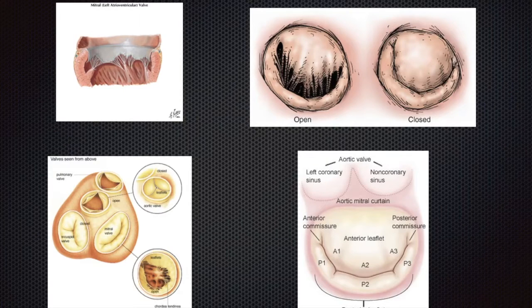So here's just drawings to show you what they actually look like. So it's a bit like a smiley face when it's closed.